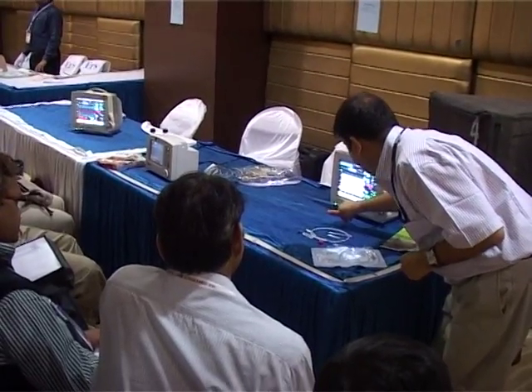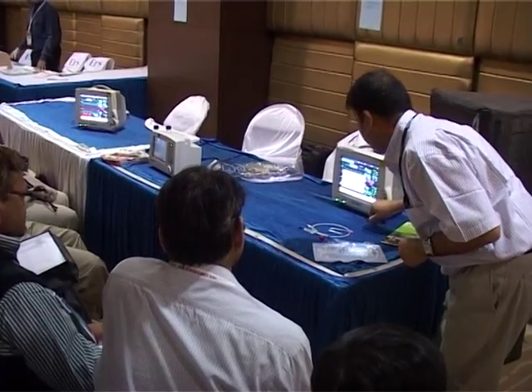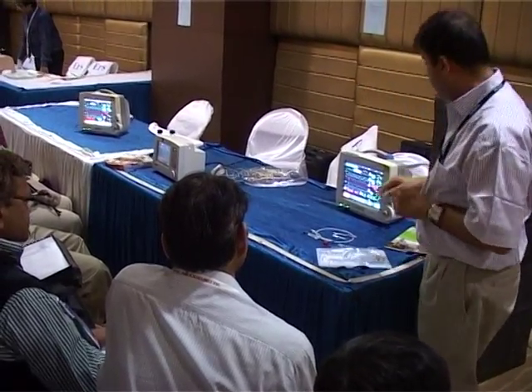Average values stored and TCO calculated. The moment I do that, you can see all the values appear on the screen at the same moment. So, what is the patient's cardiac output?